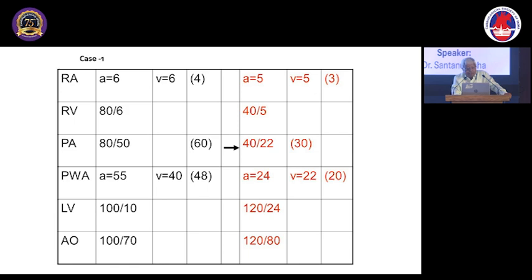And the wedge pressure, which was 48, has come down to 20. And there is hardly any gradient. The PA pressure has also come down to 40 by 22. So this is a case of mitral stenosis, pre and post BMV. So why is the LVEDP raised? It was very tight, 24.